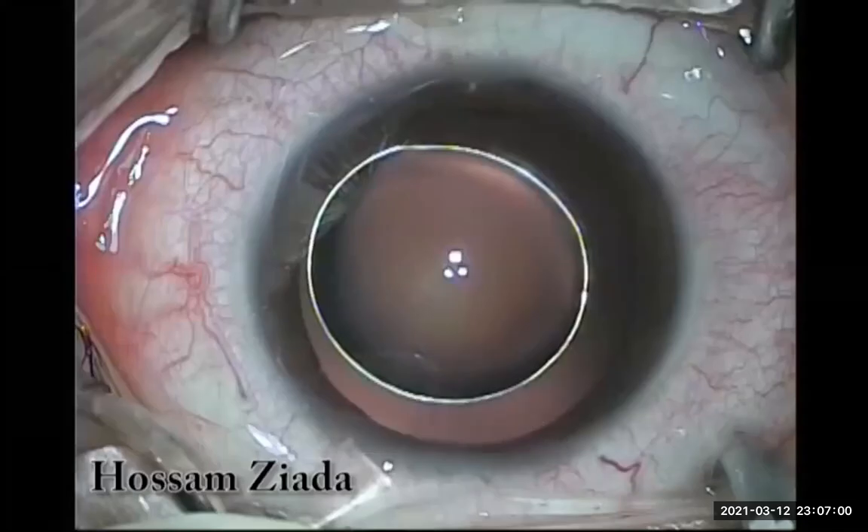Bismillahirrahmanirrahim, assalamu alaikum. Hello everyone, we are today in the academy showing you an interesting case — this lovely ball in the anterior chamber. This patient is a 24-year-old lady who came to my clinic with sudden drop of vision, ocular pain, and headache. On examination, I found this lovely ball which at first look seems like a silicone bubble escaped from the posterior segment into the anterior chamber, in front of the narrow pupil.